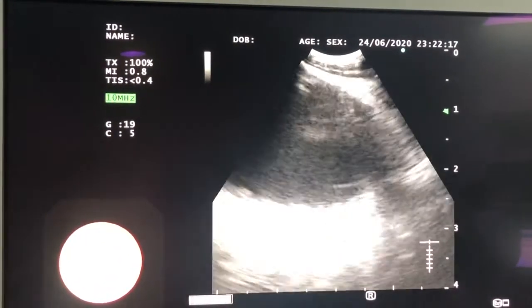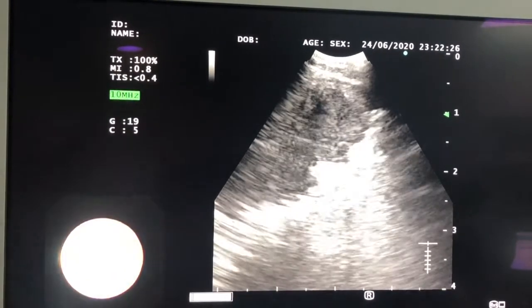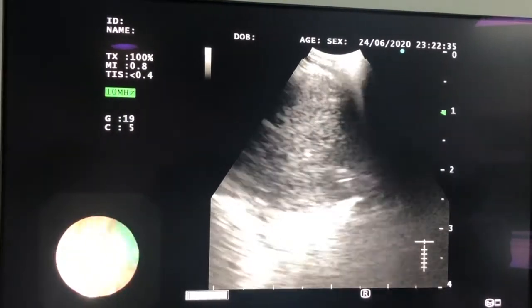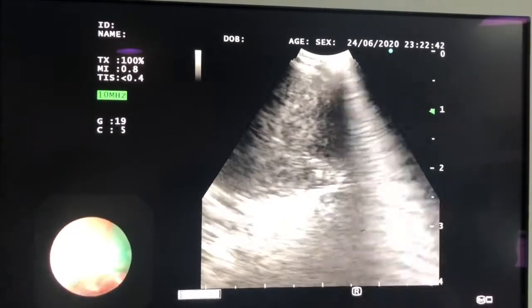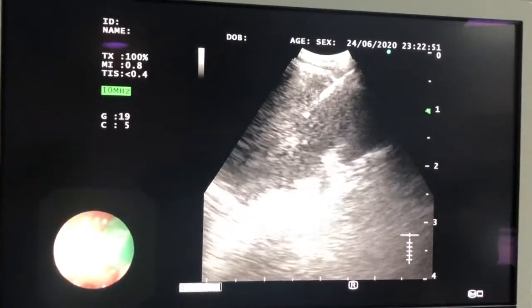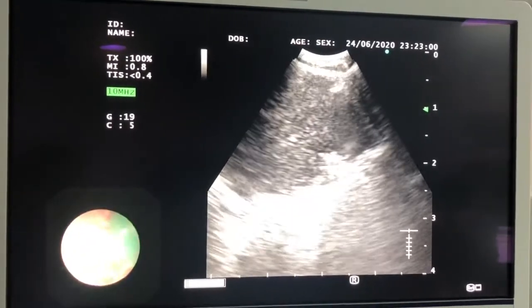Now I'm pulling the scope back up alongside the aorta and there's the arch. I can no longer see the aorta above there, so I'm now rotating the scope around to the right. On the right side of the esophagus there's the lung lesion — I can see it quite easily. I've pushed the esophagus across a little bit and have good apposition to the wall so I can see that solid lung lesion within the pulmonary parenchyma. Under ultrasound guidance I can now safely push the needle through the esophageal wall into the lung lesion, directly aspirating cells. Cytology confirmed this was adenocarcinoma of the lung.